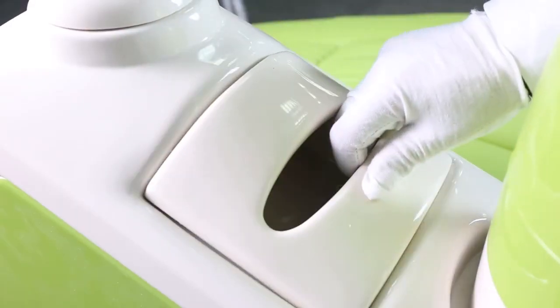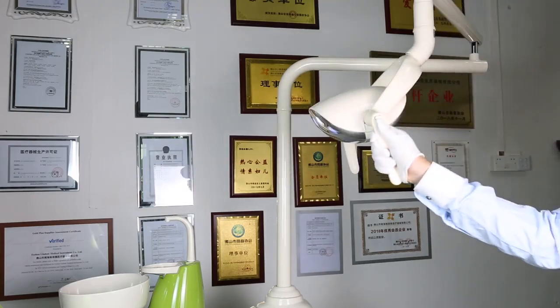The Luxury LED Sensor Lamp is easy to operate. For more details, please contact us.